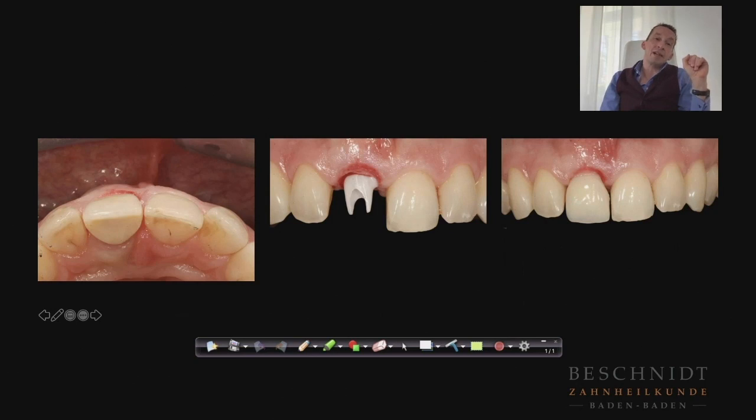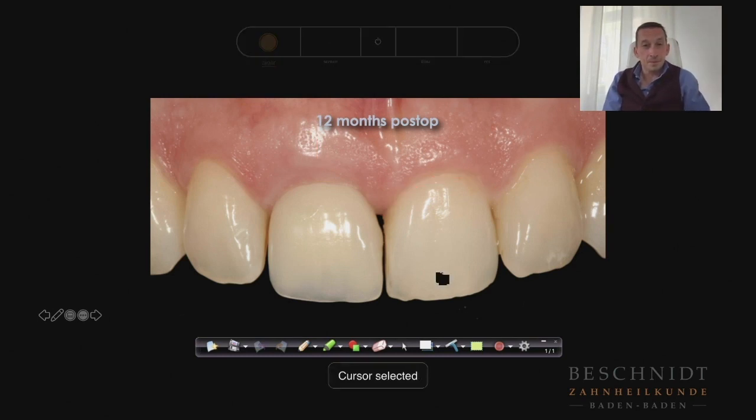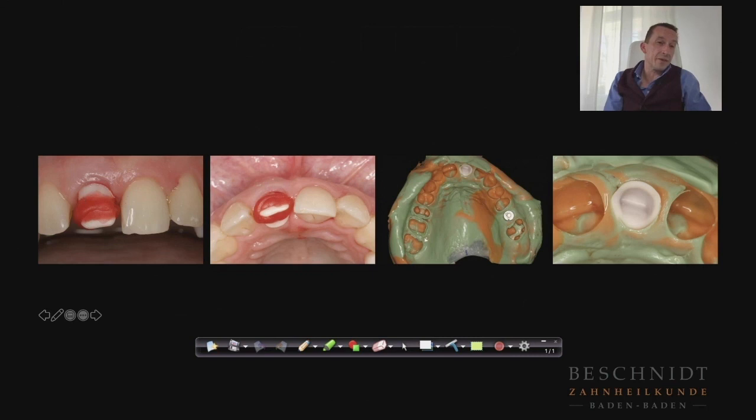I placed the final abutment with the platform switching on the Camlog, and this is the long-term provisional on the right side. After 12 months of healing, you see we still have more soft tissue compared to the other side. So we could do the final crown with a little more volume on the buccal side here. We did a final impression with the transfer cap. I didn't take out the platform switched abutment anymore.